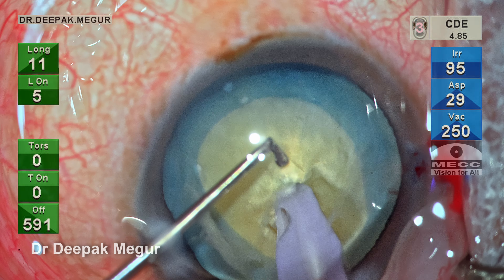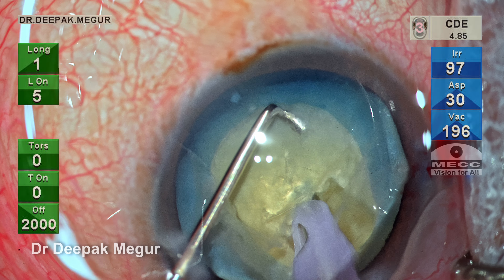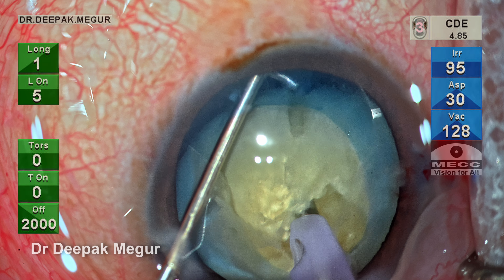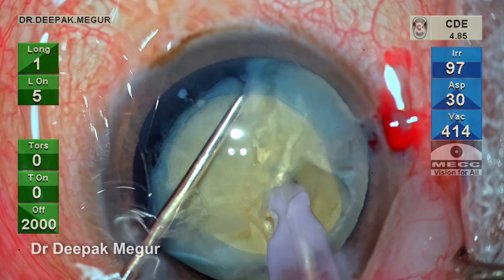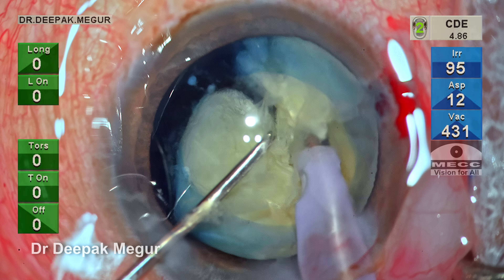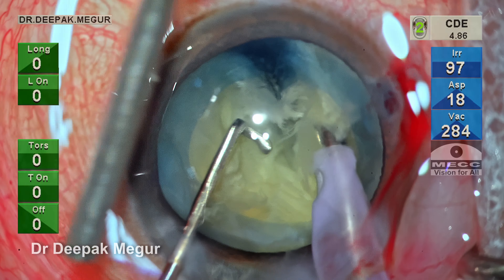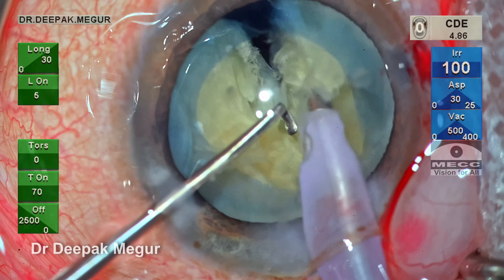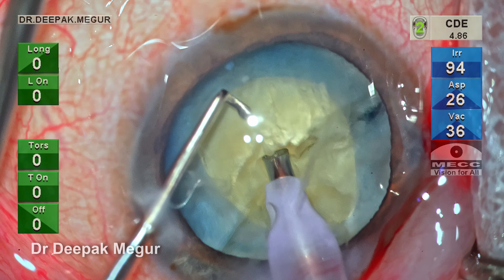There's a slight pull of the nucleus towards myself so that the equator is exposed easily, and then the chopper goes under the rhexis margin, hooks the equator of the nucleus, and is moved towards the phaco tip. As we can see, there is hardly any torque and the nucleus can be split quite easily. It may not go full through-and-through — that doesn't matter. You do a little bit of lateral separation, then rotate the nucleus and repeat the same maneuver.